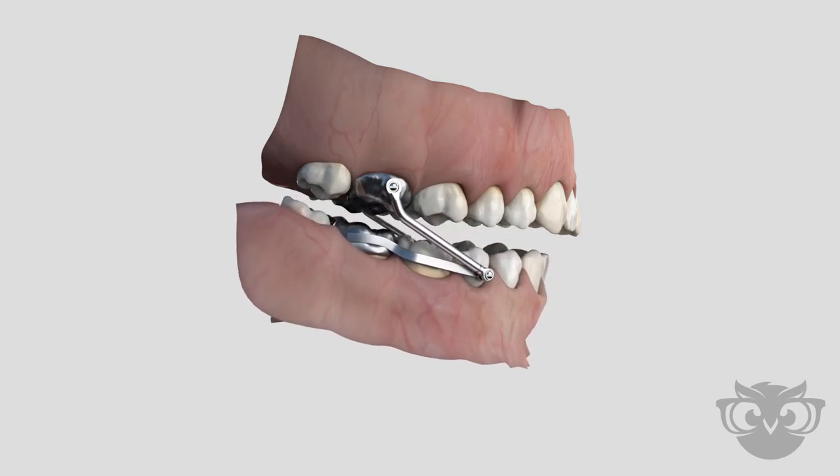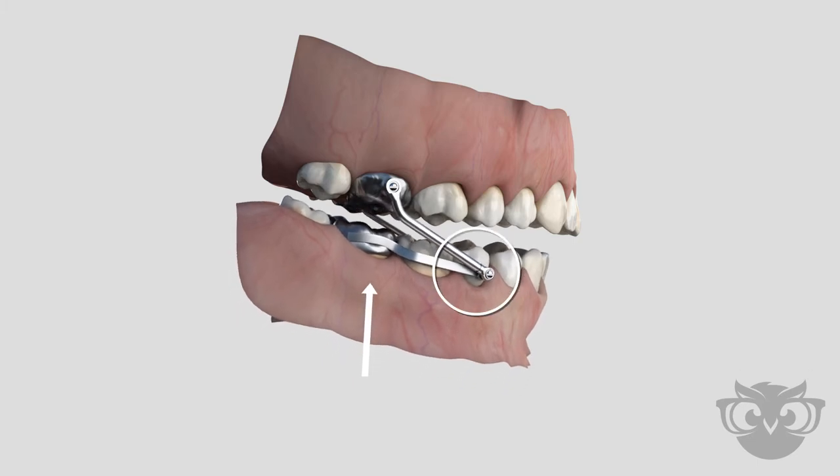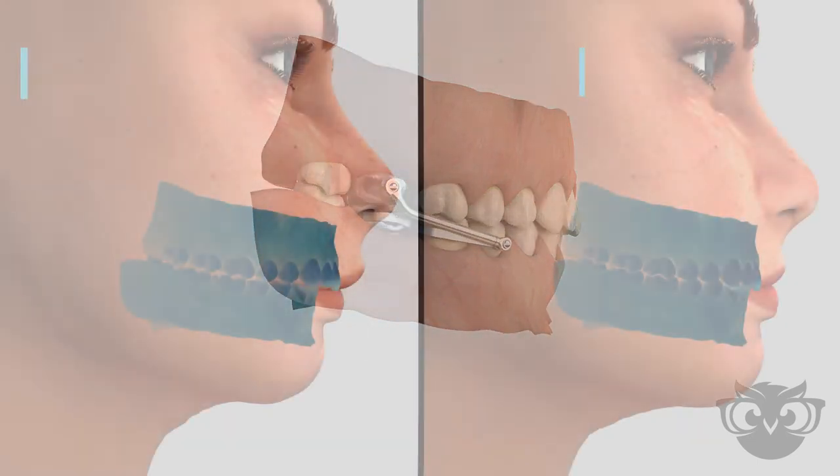Over time, this guidance leads to correction of the bite and jaw relationship, resulting in improved function and overall aesthetics.